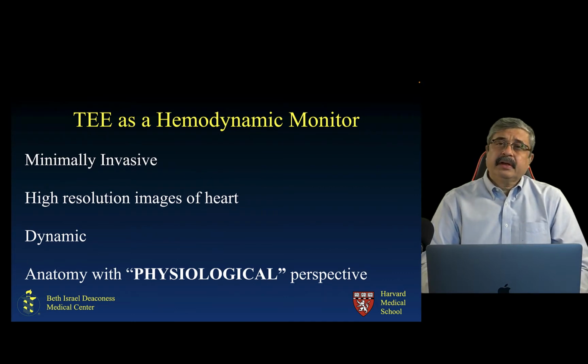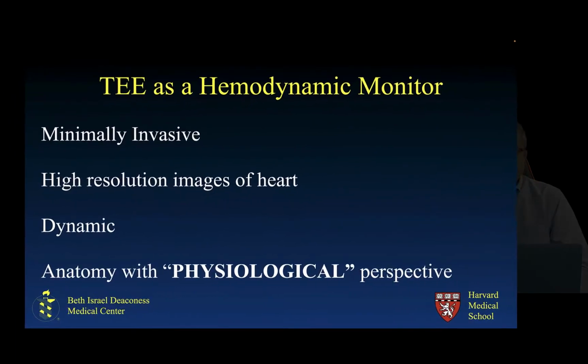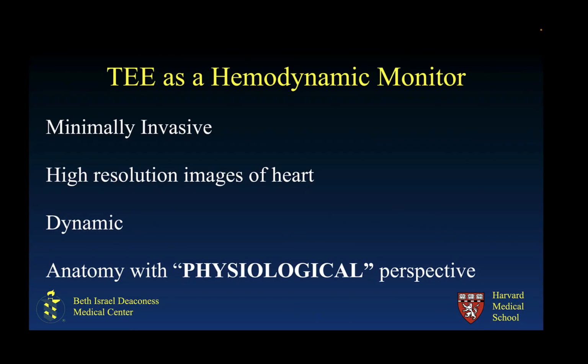Most important being that it is minimally invasive. The patient just has to swallow the TE probe. It generates high-resolution images of the heart, displays dynamic anatomy, and most importantly, we'll get to it, is anatomy with a physiological perspective. There's a lot more that we can get from transesophageal echo than the structural information that we shall discuss in a second.